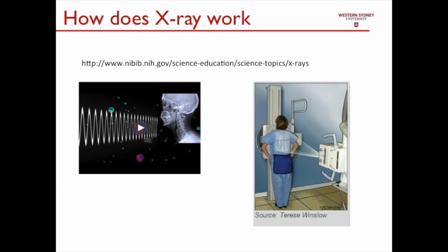As a result, bony structures will appear whiter than other tissues against the black background of the radiograph. Conversely, X-rays travel more easily through less radiologically dense tissues such as fat and muscle, as well as through air-filled cavities such as the lungs. These structures are displayed in shades of grey on the radiograph.